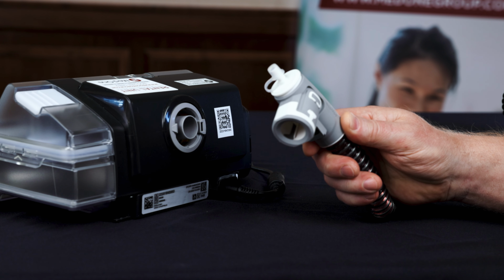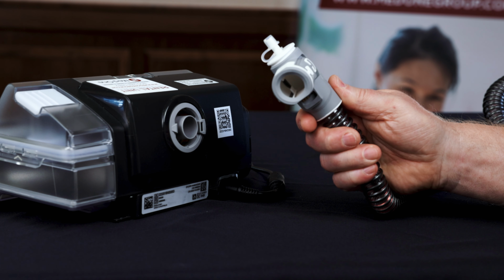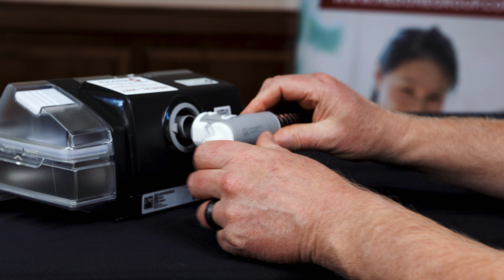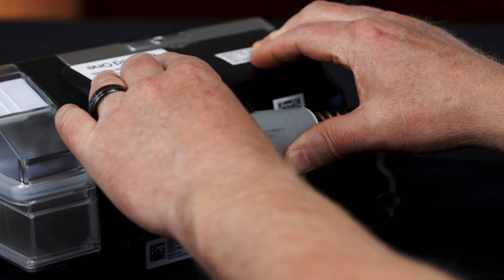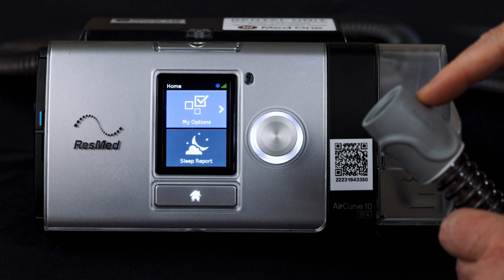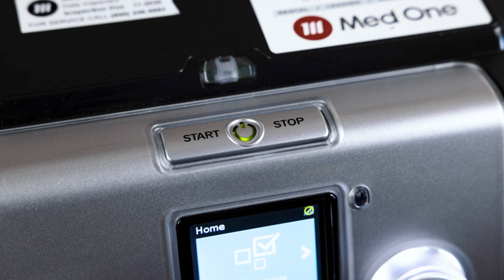Now I'm going to demonstrate how to connect the circuit to the device. Be mindful of the heated connector. It needs to line up with the port. Push in until you hear a click. Next, connect the interface. Lastly, to start therapy, press the start and stop button.